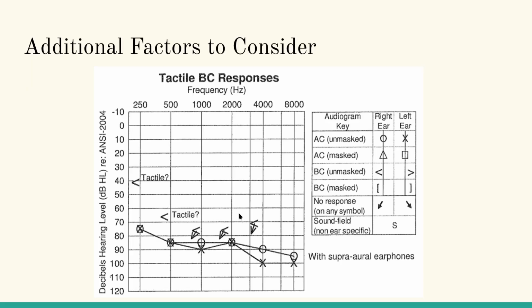There's been a study that looked at the reliability of patients being able to differentiate the two, and they often can't differentiate the two. They often will tell you they felt the response, but whether they felt it or heard it, it's really hard to say. We can be pretty confident in this case that they felt the response, unless the tympanogram was abnormal.